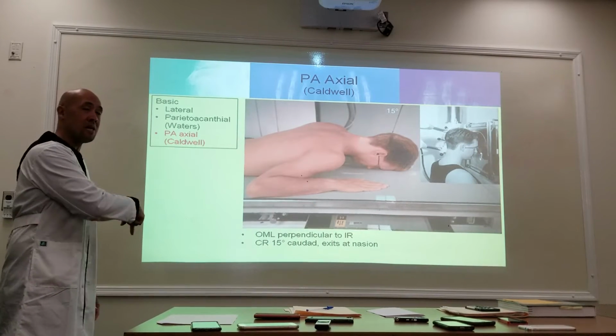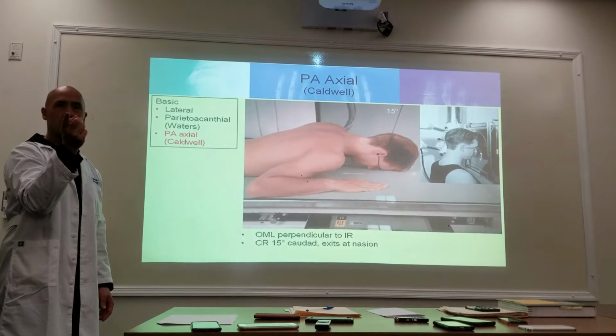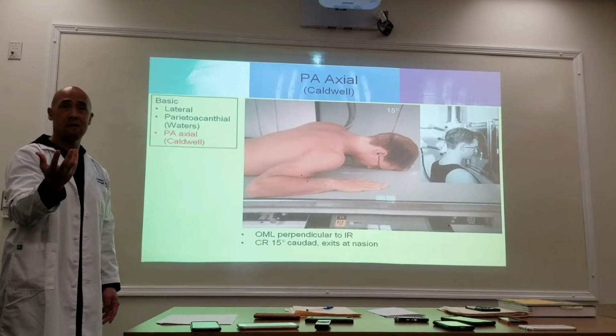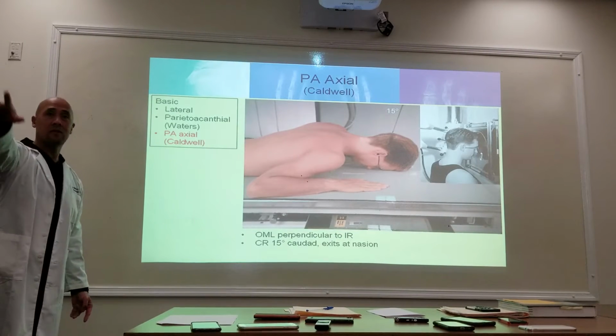Now if it's an AP, how many of you shot your skull AP in your lab? Okay, so you guys did both. You did PA and you also did AP. Just AP. So if you do an AP, which way is your angulation now? Cephalad. Okay.